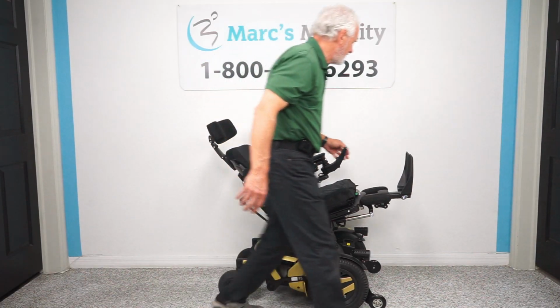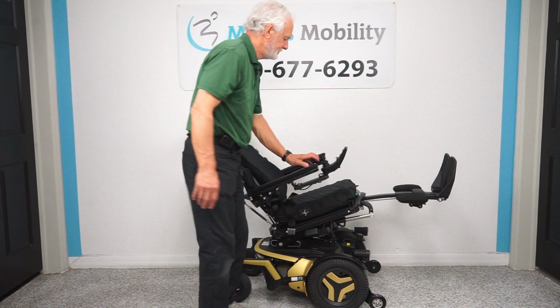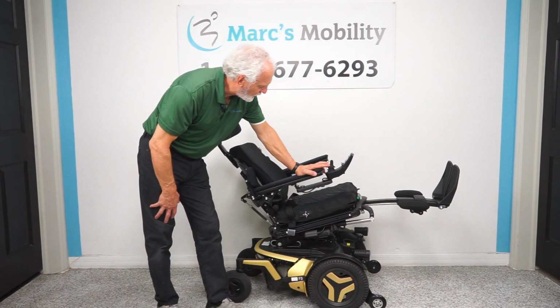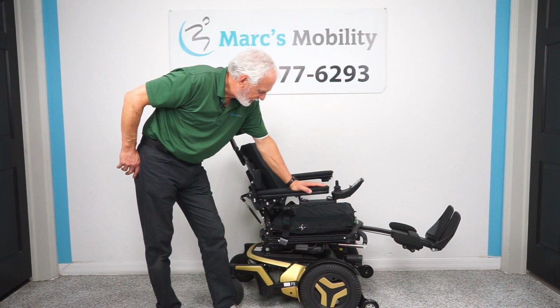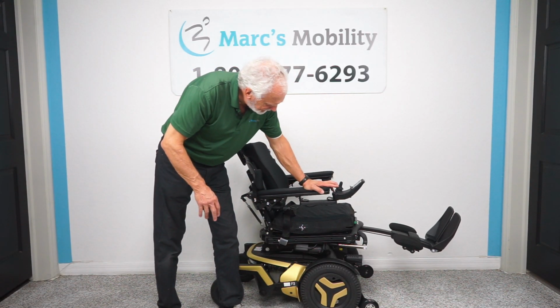So right here is halfway tilted. Your feet would still be higher than your body, okay? And we're gonna bring it all the way down. So as I said, I'm gonna bring it back down. So the seat is back down, all the way down.